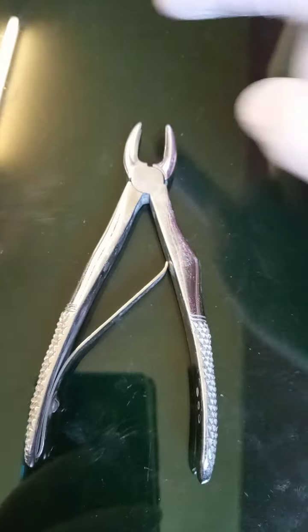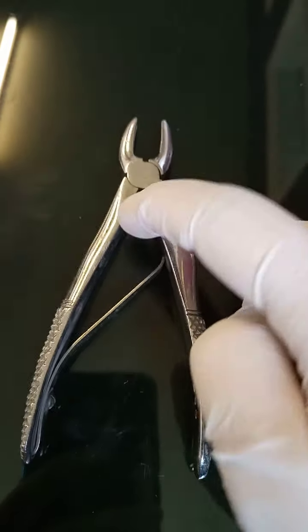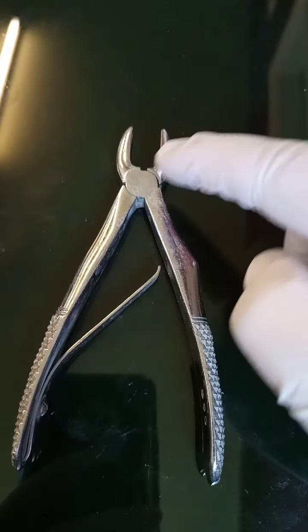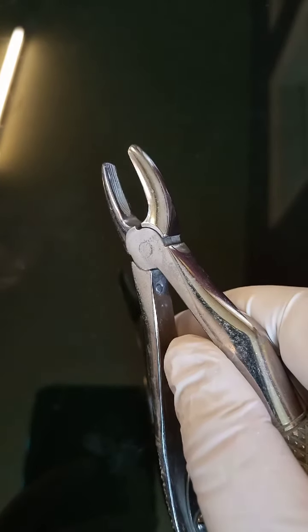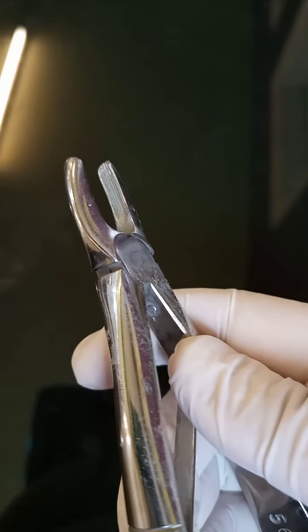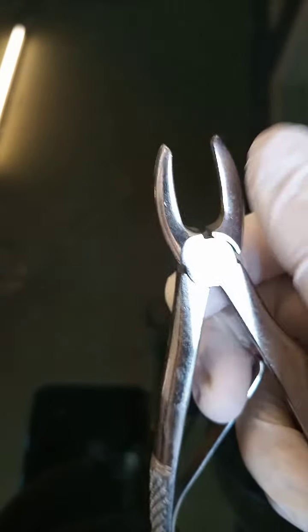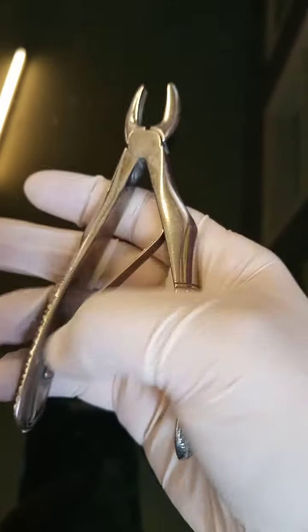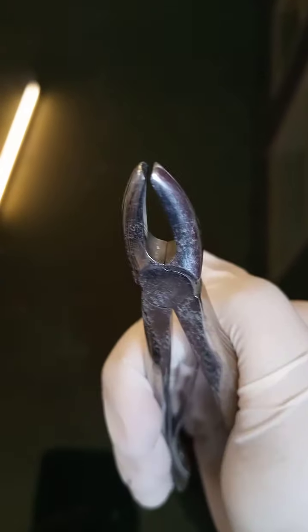This is upper anterior forceps. It has beaks, hinge, the handle. In between the handle is the dental spring. The beaks are usually concave and serrated from the inside in order to grip the tooth and prevent the slippage of the tooth from the socket during the extraction. The beaks are attached to the handle with hinge. The dental spring usually helps the easy grip of the forceps.